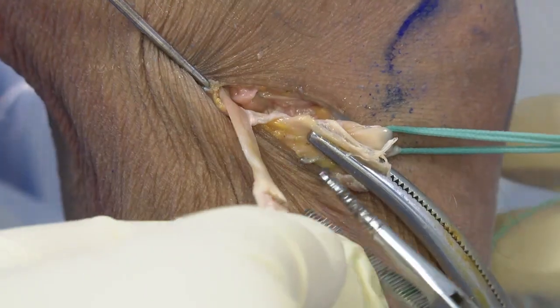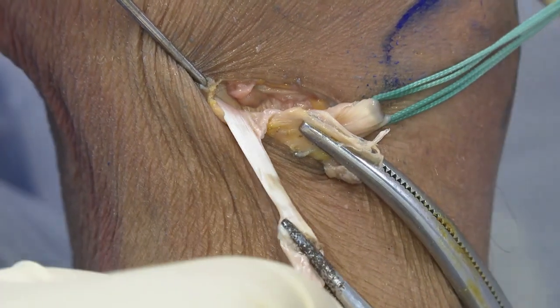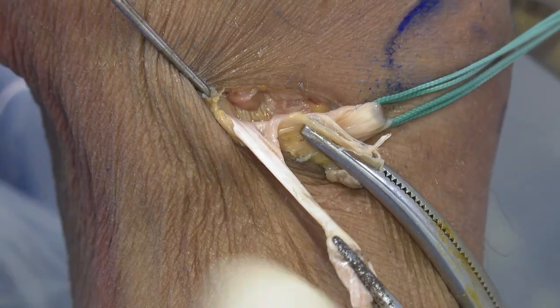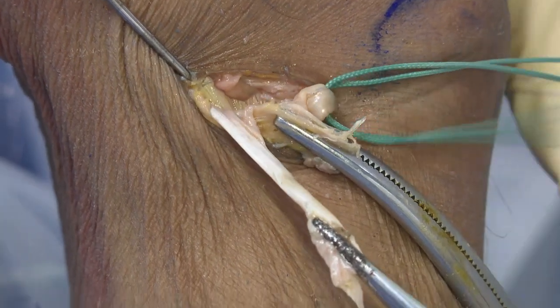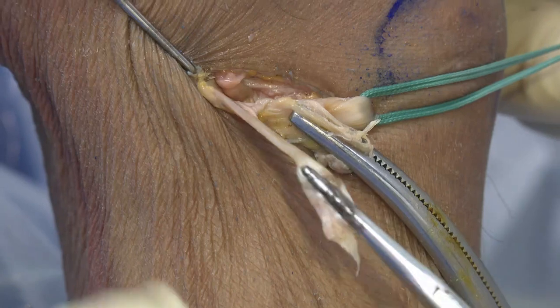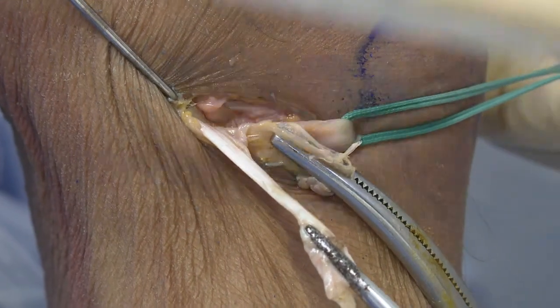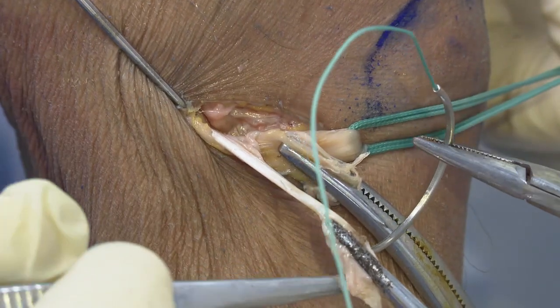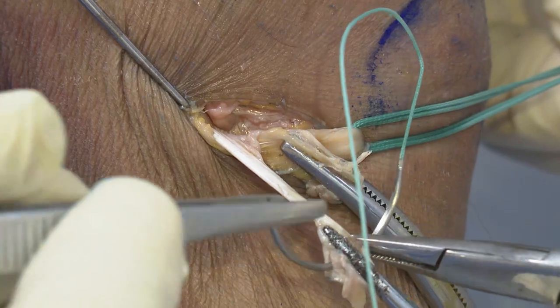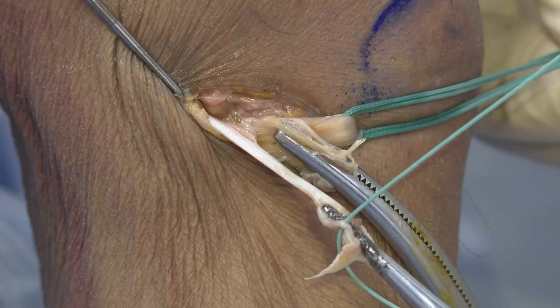Okay, so now we can suture and harvest this one first. I do it this way because I want the tendon as long as possible. So that's why I go to the tubercle and cut it. You can get another 2-3 centimeters. That's quite important. Okay. So here you can free it up to the tubercle, and this way the harvested length will be better. Okay. And then we repair this.